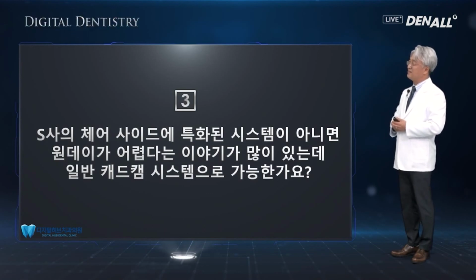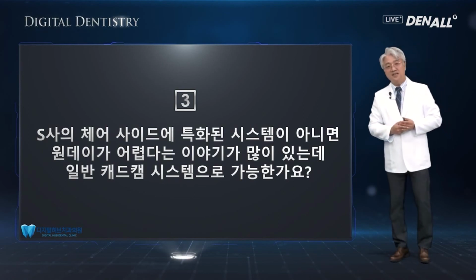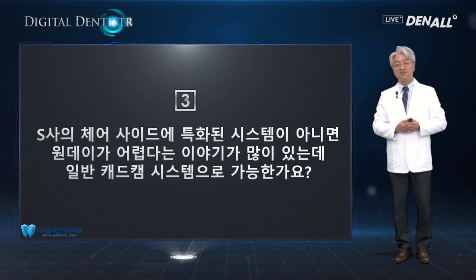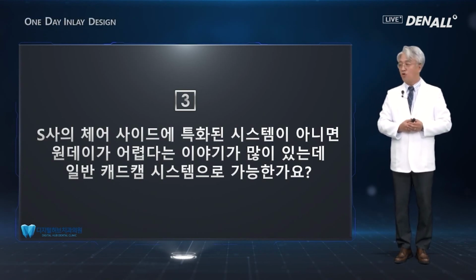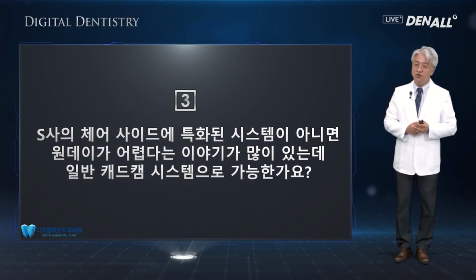So, third question: the company has a chair-side customized system, and without that system, many say one day would not be possible. Can we use a general CAD/CAM system for the one-day approach? I believe this person studied a lot about CAD/CAM systems. Yes, it was so up to now. I think I know the companies you are referring to, but their CAD/CAM system has been customized for the one-day approach.